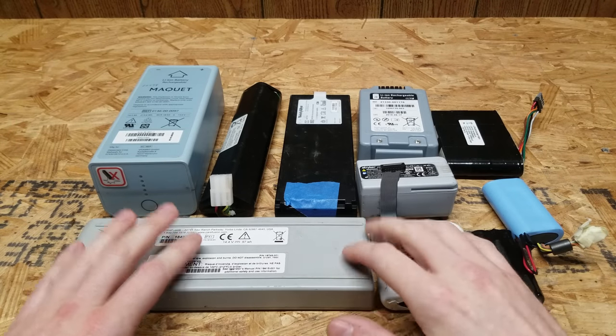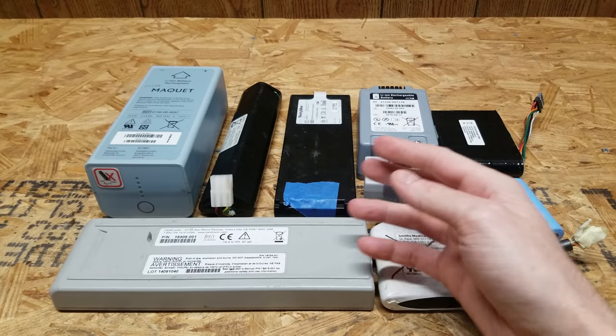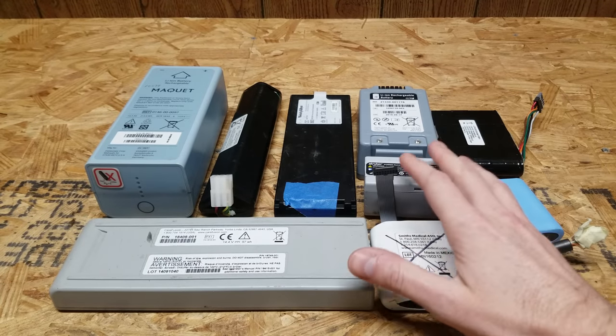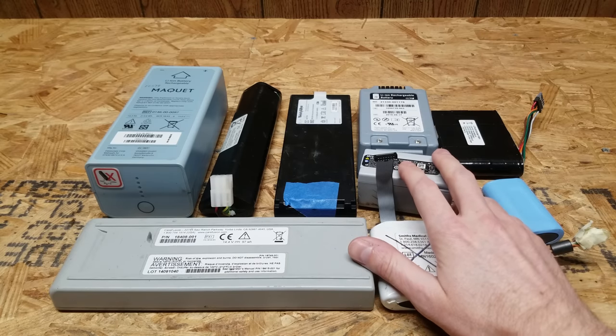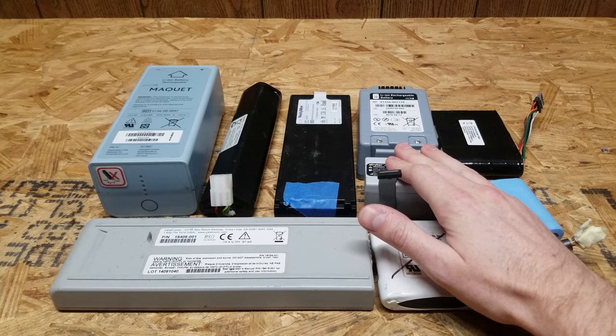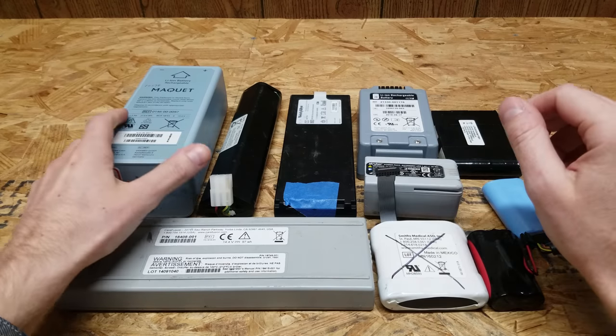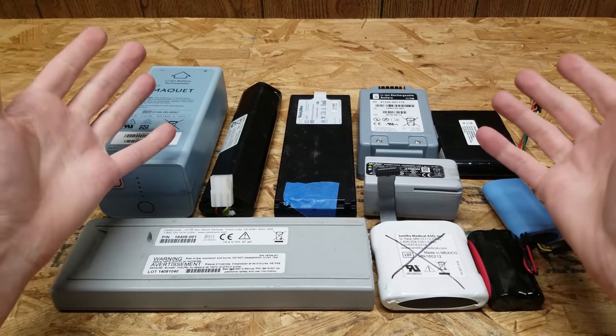Hey guys, I have here a box of assorted medical battery packs from Battery Hookup. They sent this box out to me and asked if I could recover the cells, do some testing, and calculate out the price per kilowatt hour that this box would be valued at. Medical batteries tend to be replaced frequently to ensure reliability of equipment in hospitals and doctors' offices, so there is typically plenty of life left remaining in these batteries and cells, if they were even used at all.